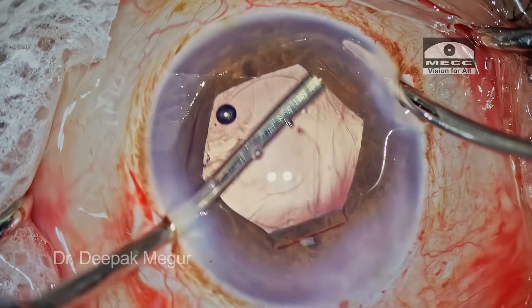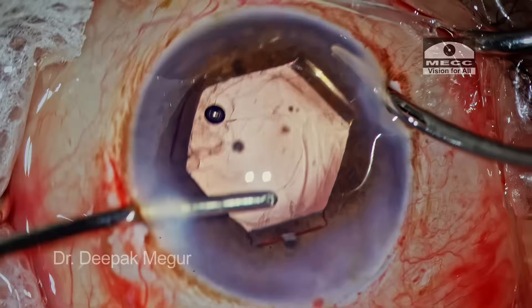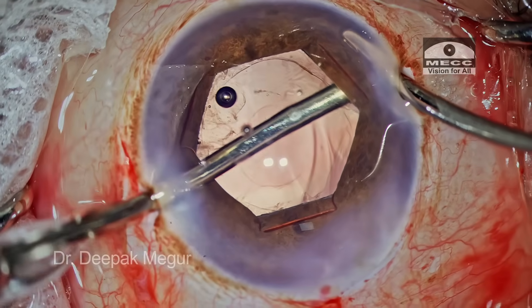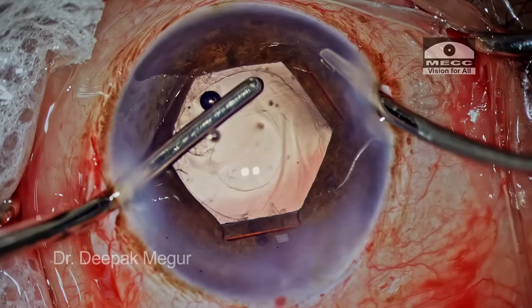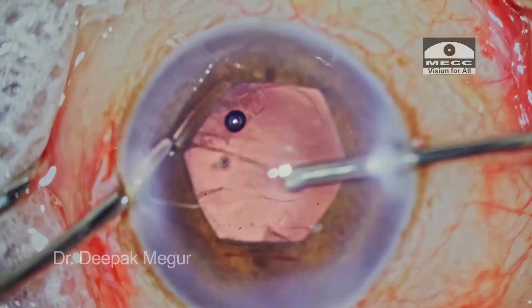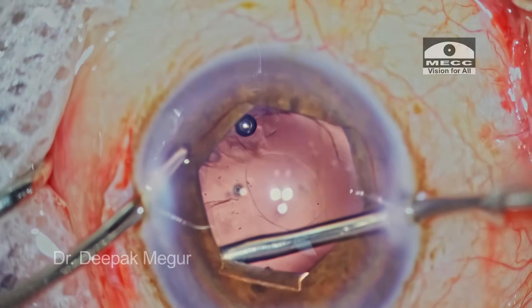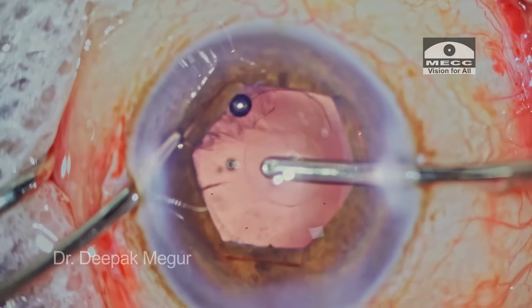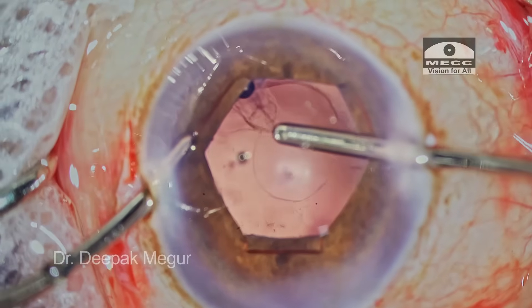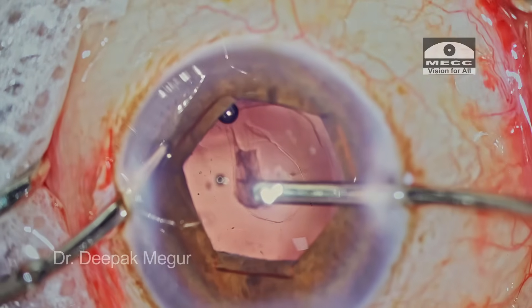Slowly but surely, each of the cortical fibres is gently aspirated out. Remember, cortex is dealt with only once the prolapsed vitreous has been dealt with. If there is any evidence of vitreous present, stop the cortex aspiration and go back to perform anterior vitrectomy once more. The hands are switched and I go behind the pupil, engage the cortex, strip it off and aspirate. This process is continued until all cortex is aspirated out. The last fibril is posing a little issue as it is prolapsed, but the cortex is now totally out.